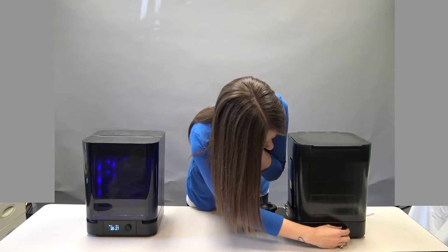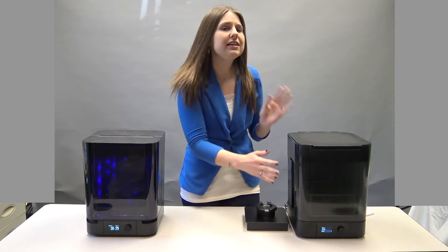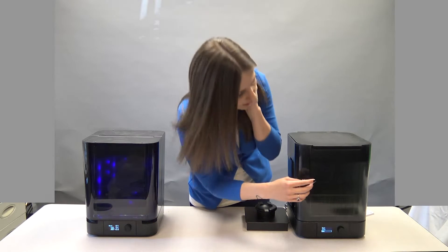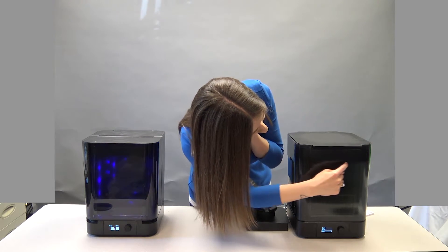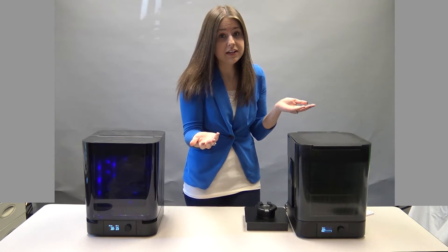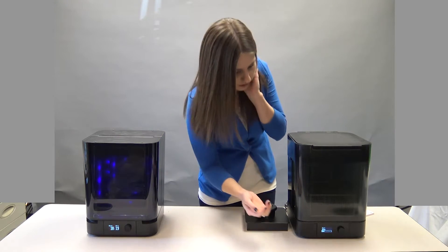Now I'll show you how to load it. I'm not going to actually start it because it is empty. You do need to fill it with isopropyl alcohol — there's a fill line right on the front here. You just fill it to that line and it's ready to go.